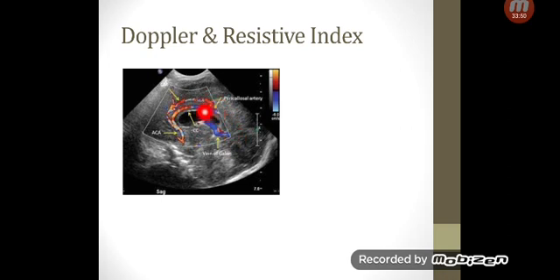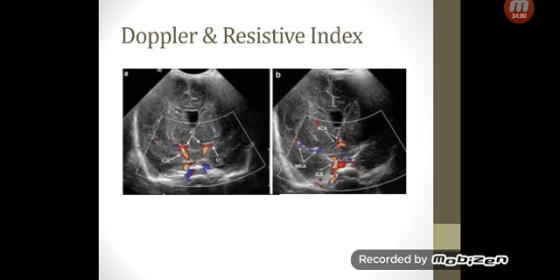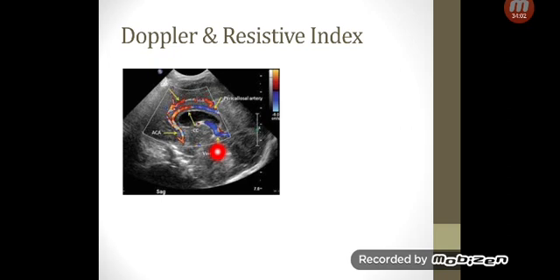Usually with your hand tilting you can appreciate the veins as well beside the pericallosal artery. So the vein of Galen is really important, and we're also going to come up to that. So that's what you can see from the sagittal. At least that's what is important for us from the sagittal view.